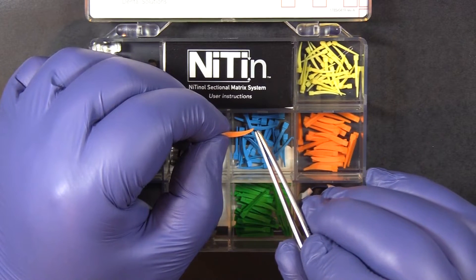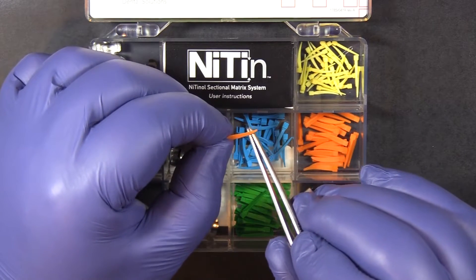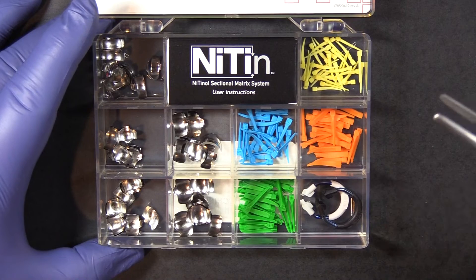It's got this nice little ski-type tip on it, and that's exactly what that's for — as you're inserting the wedge, it will glide up over the papilla and rubber dam and not dig in.